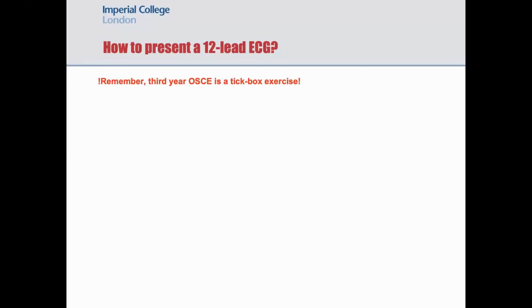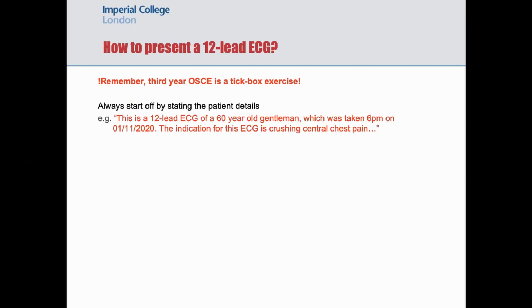So it's brilliant if you can spot the diagnosis, but to get the highest possible mark, you can't just say what the diagnosis is and not present the rest of the ECG. You have to talk about every component. So I've just got a rough structure in the rest of this slide for you. Essentially, always start off by presenting the patient details.